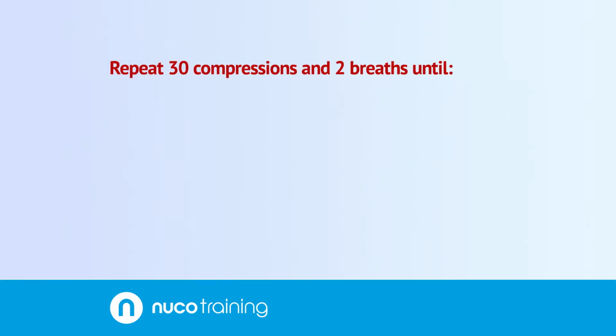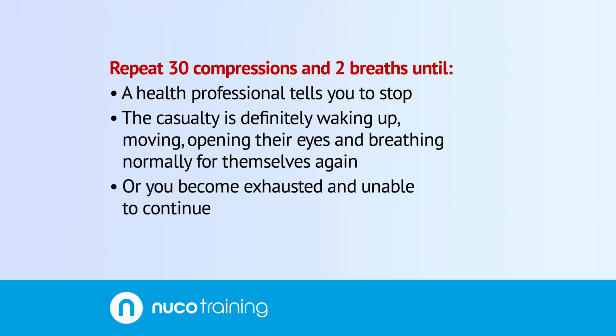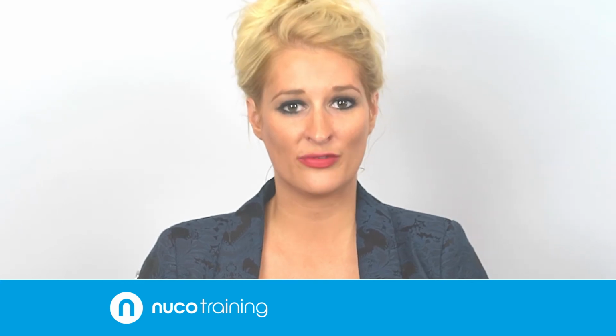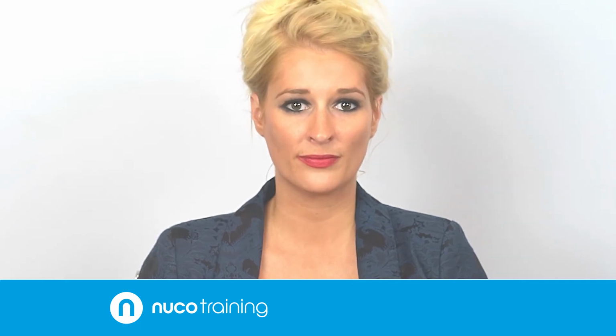Repeat 30 compressions and 2 breaths until a health professional tells you to stop, the casualty is definitely waking up, moving, opening their eyes and breathing normally for themselves again, or you become exhausted and are unable to continue. It must be emphasised that if you are unable to give rescue breaths for whatever reason, then you must continue with chest compression only CPR.